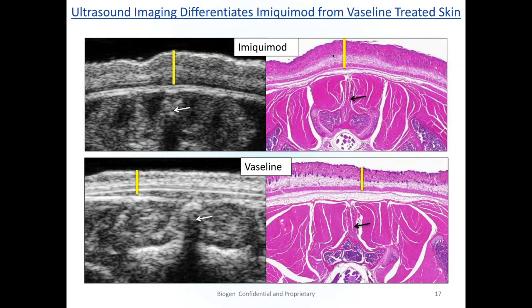There's actually a couple of publications. So the whole hair growth cycle: once the hair is removed, it's about a 3-week cycle till you get a rapid proliferation of the hair follicles and the next stage of growth. Although we do see some growth starting even 9-10 days after the first hair removal.